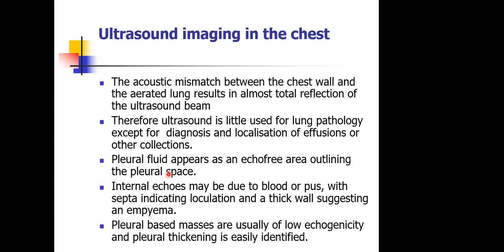And it happens. Many times patients are sent to imaging even right here, and when you do imaging, you find that somebody has put the tube past the pleural space. The tube is into the lung tissues. There are times when you find the tube is actually almost perforating into the heart. That is the importance of imaging guidance for such a procedure.